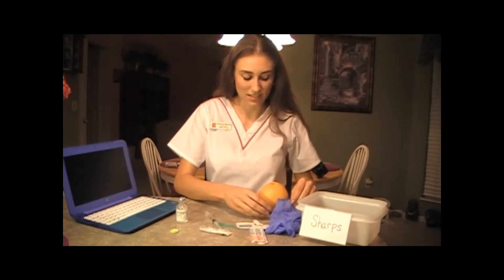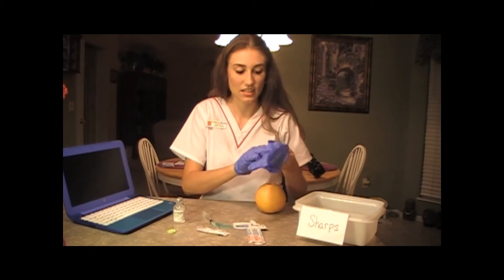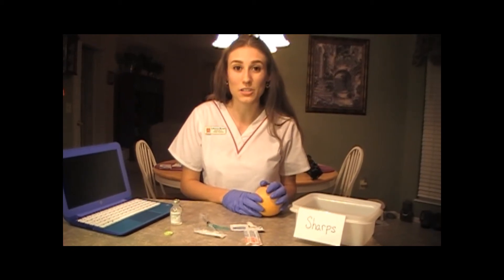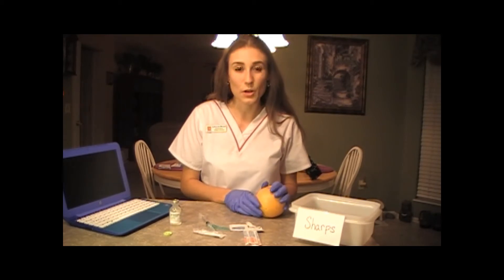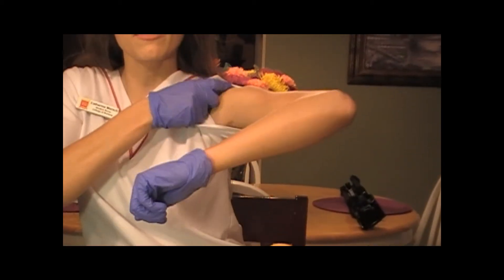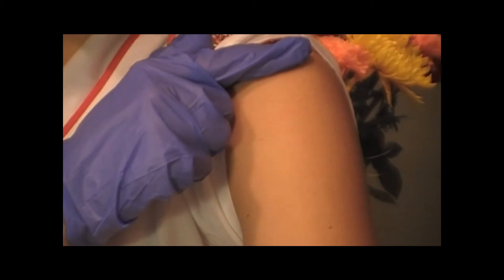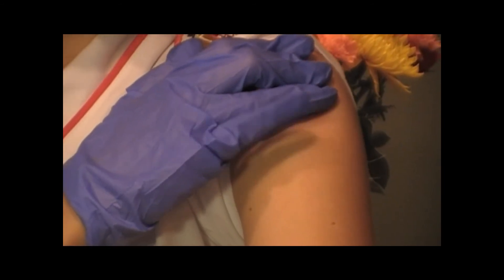This orange is going to be my patient. I'm going to use proper hand washing technique, put on my gloves, and then use proper patient identifiers — asking my patient their name, date of birth, and if they have any allergies to the medication I'm about to give them. Since I'm giving a flu shot in the deltoid, you want to palpate to find the right landmarks. You're going to feel for the acromion process at the top of the shoulder and go about one to two inches — or two to three finger lengths — below that, and right underneath that is your injection site.